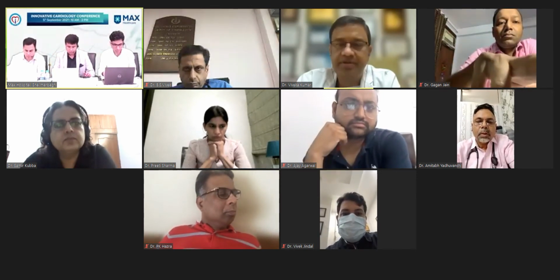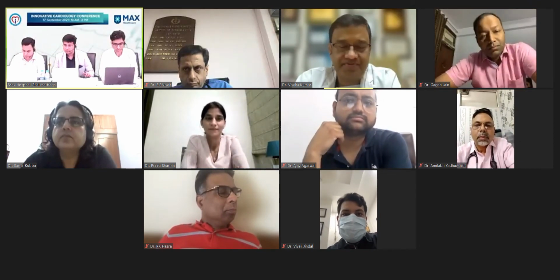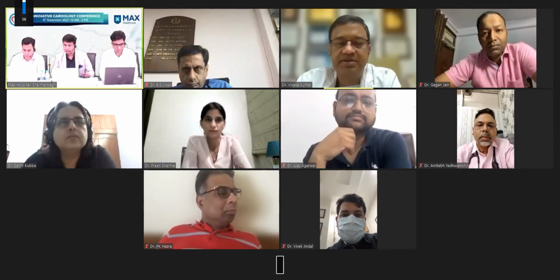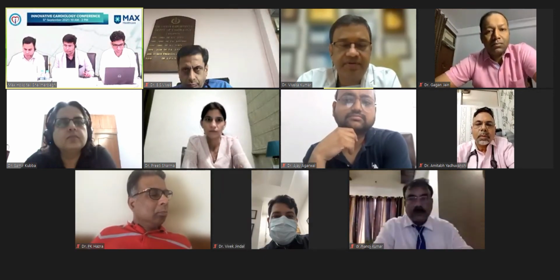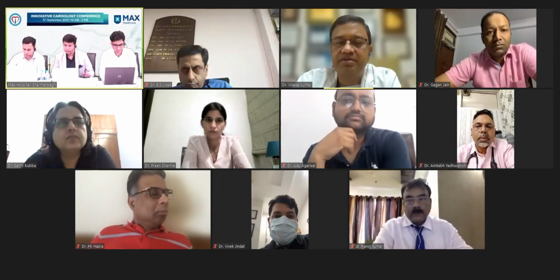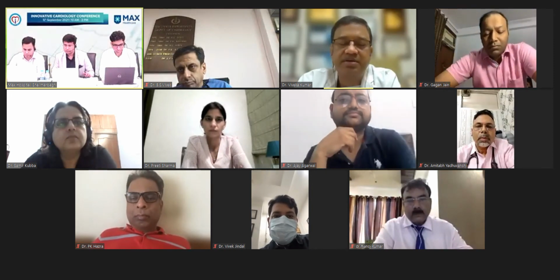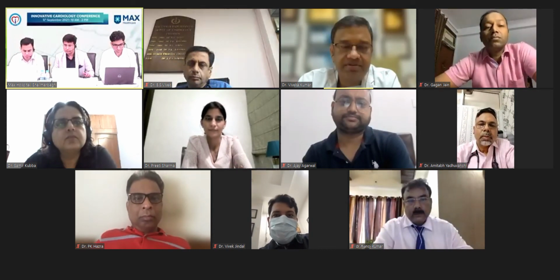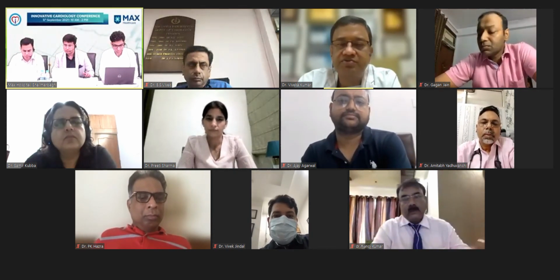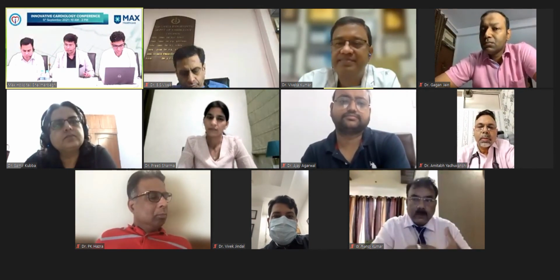Yeah, so Dr. Preeti, I think she would like to say something on the role of OCT in complex situations. So these are the situations like stent failure, restenosis, left main. So there are certain situations where we must use an imaging technique, be it OCT or IVUS. So any comment, Dr. Preeti, on where one must use OCT kind of imaging?